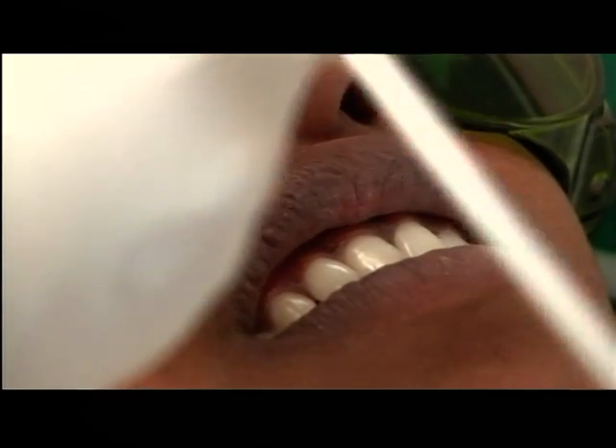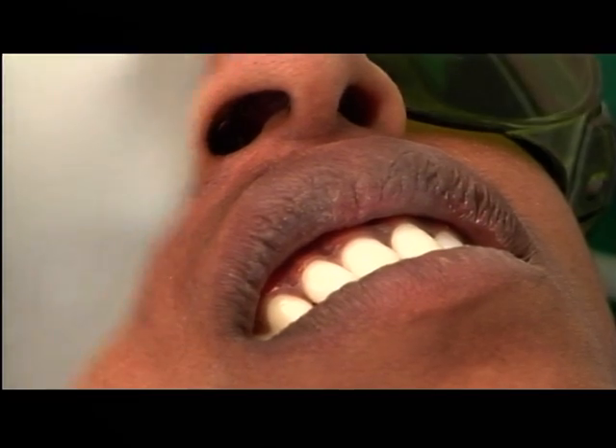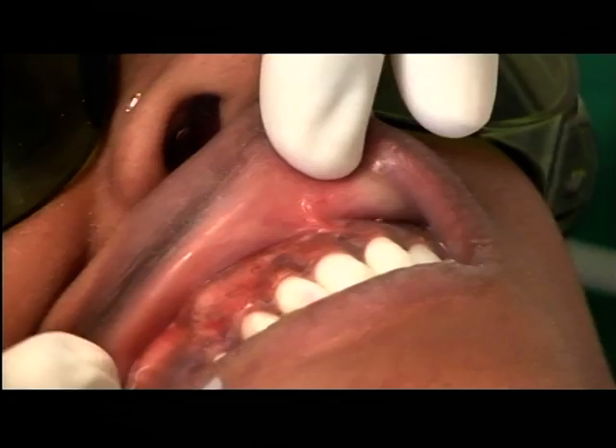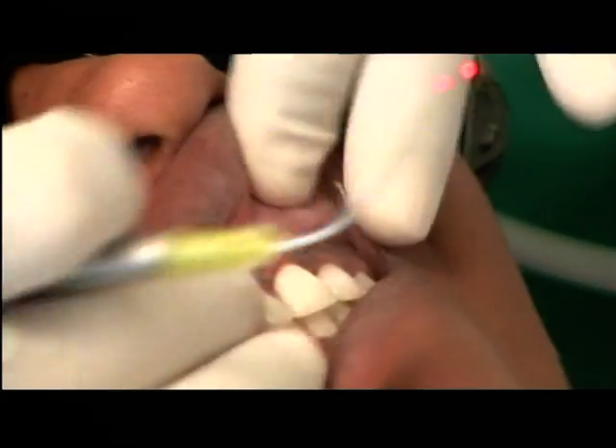There are no real masks needed, but you can put two masks if you want — you have to have a smoke evacuator. So we have just done this area; you can already compare it to the other side.